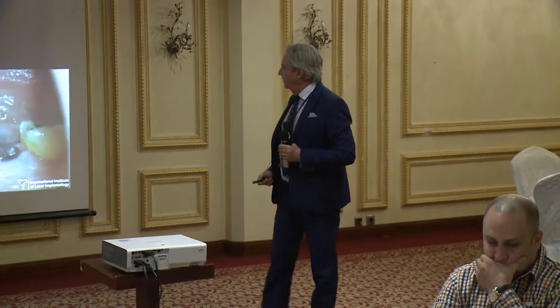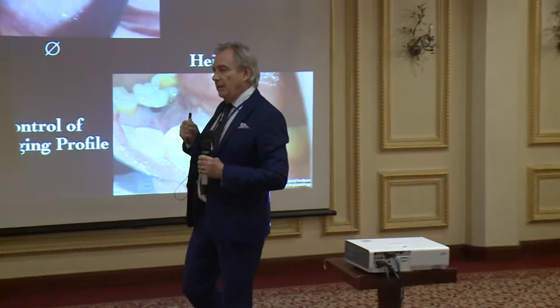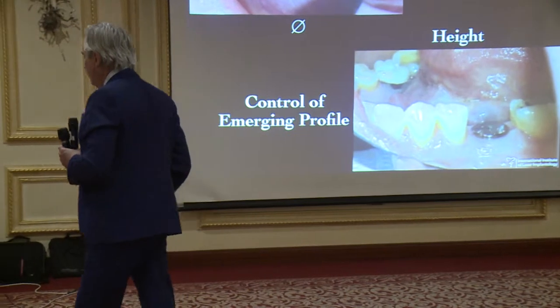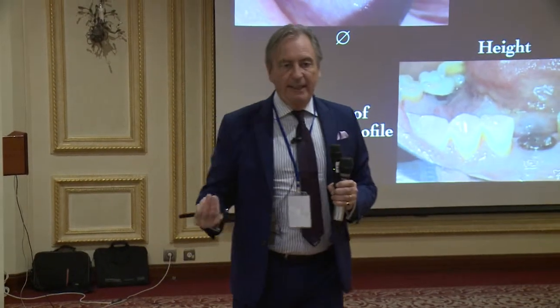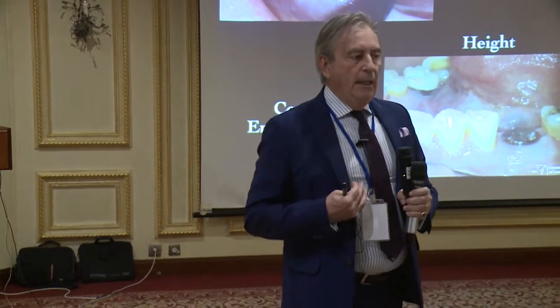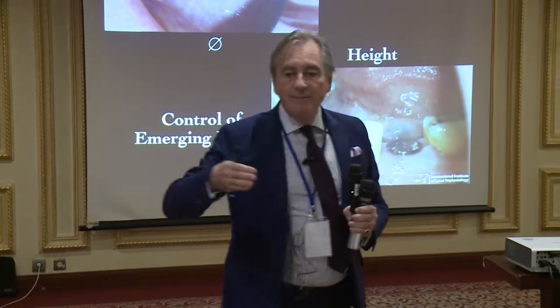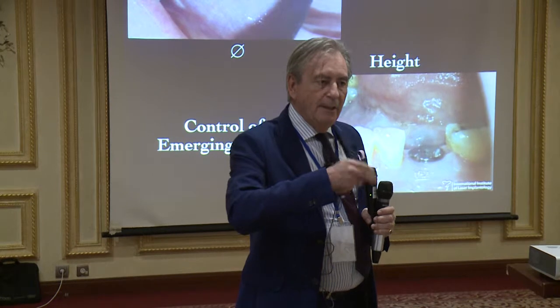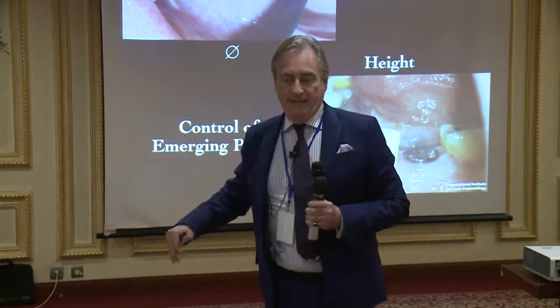We shift to this soft tissue management. Soft tissue management is a critical issue. And actually, that was one of my first mistakes that I made clinically, because at the same time I wanted to avoid the use of biomaterial, but at the same moment I wanted to have a nice healing.